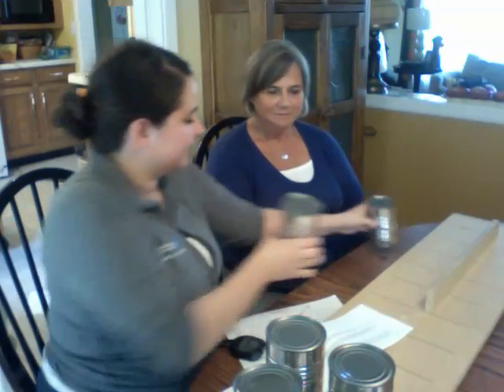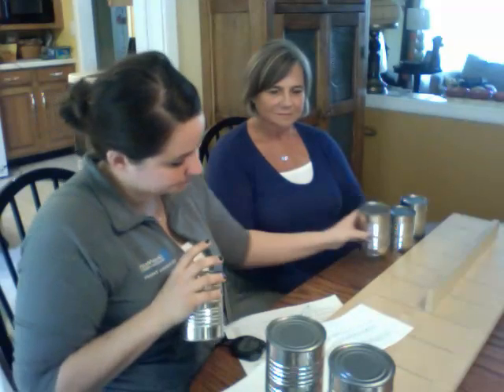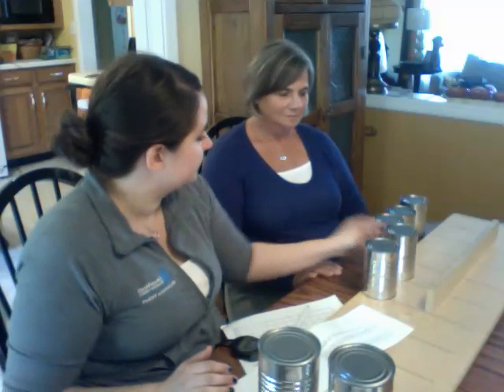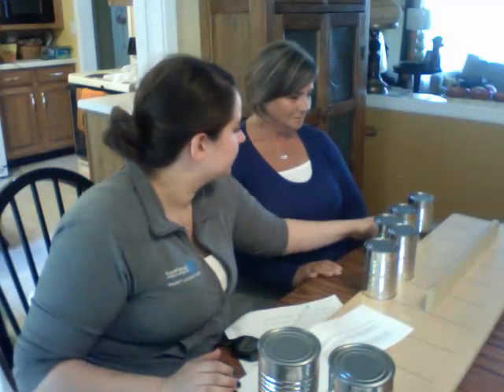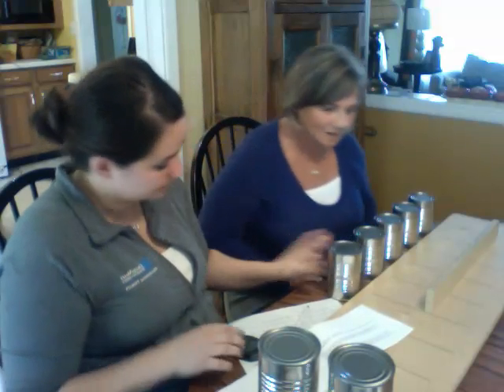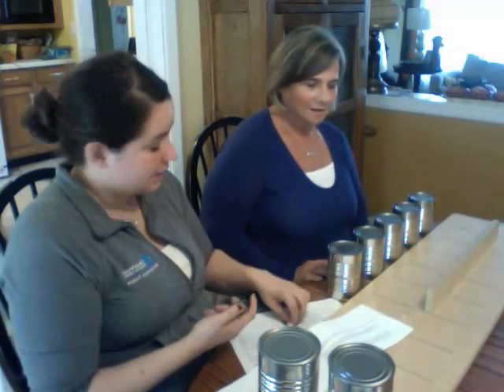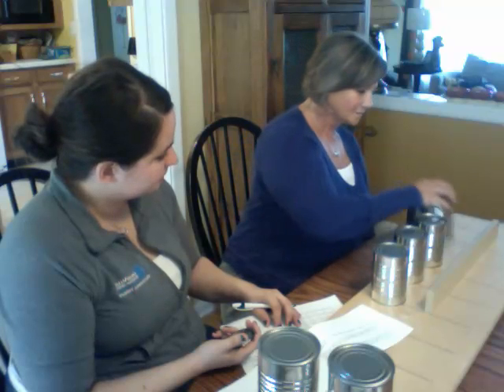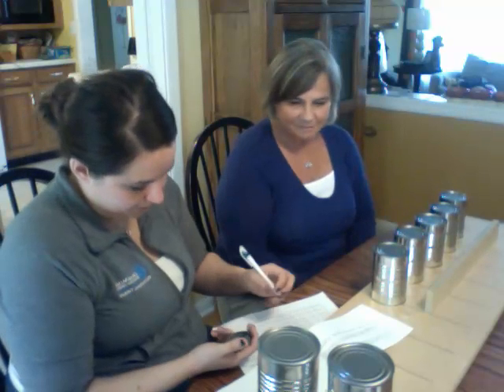This one is kind of noisy. So I'm going to place these cans in front of you. And using your left hand on the table, starting on the table. Oh, where's the other right one? There it is. When I say go, use your left hand and stand these cans on the board in front of you, just like this, okay? Put them all up there. Just space them out appropriately. All right, do you understand? Yeah. All right. Ready? Go. Very good.